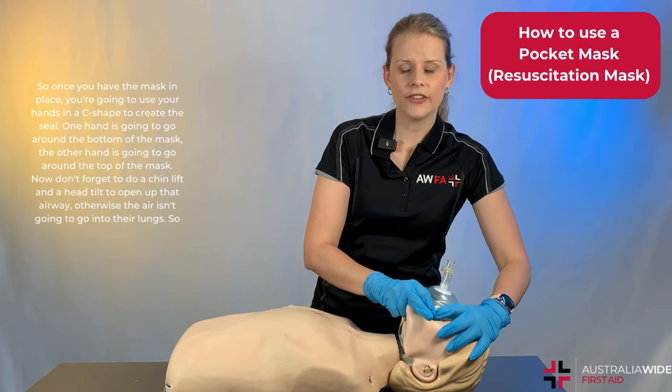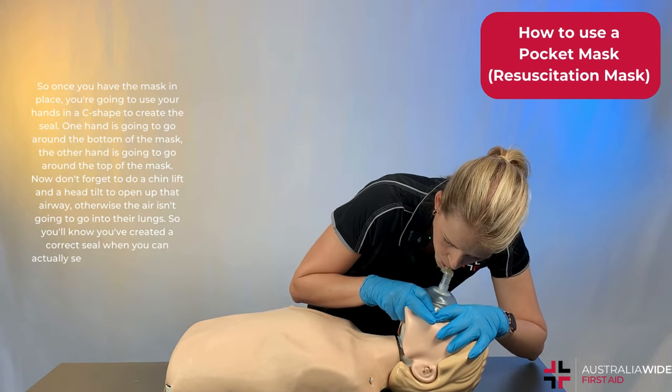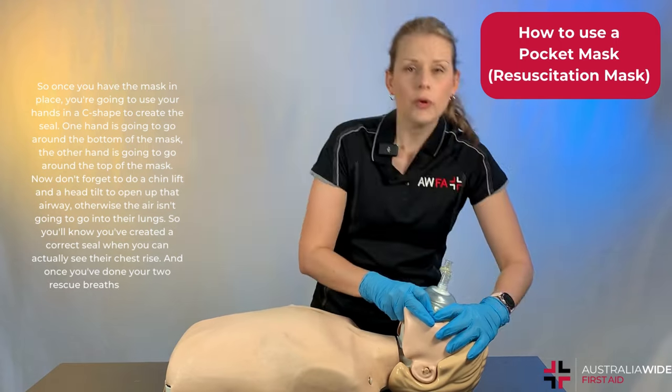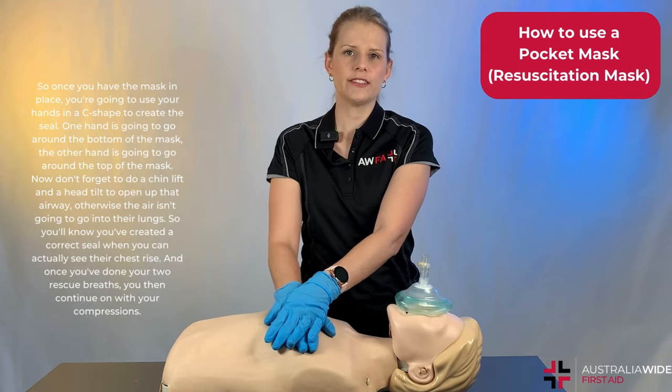You'll know you've created the correct seal when you can actually see their chest rise. And once you've performed your two rescue breaths, you then continue on with your compressions.